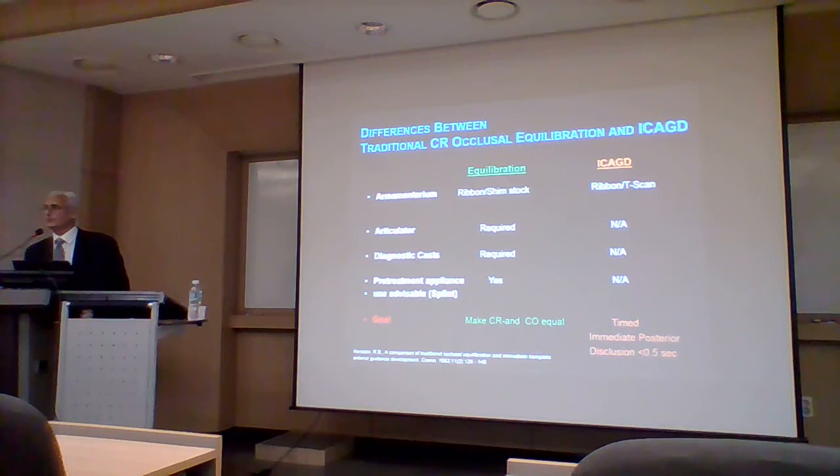So this therapy is not new, but it's new in that most of us weren't using the T-scan in 1985, 1991, 1995. And only now, in 2015, 2016, are people taking the T-scan as an important tool. So this approach has been around for a long time, but because the T-scan has been slow to reach acceptance, this therapy has also been slow to reach acceptance.